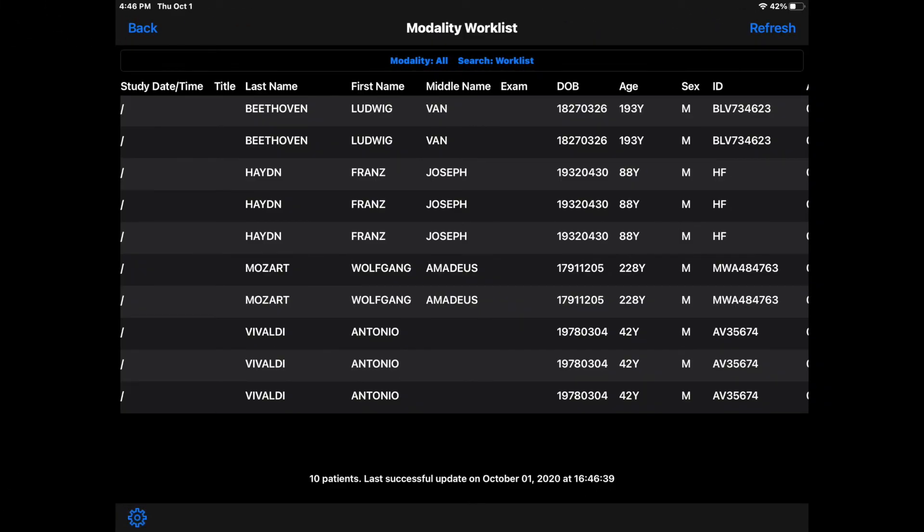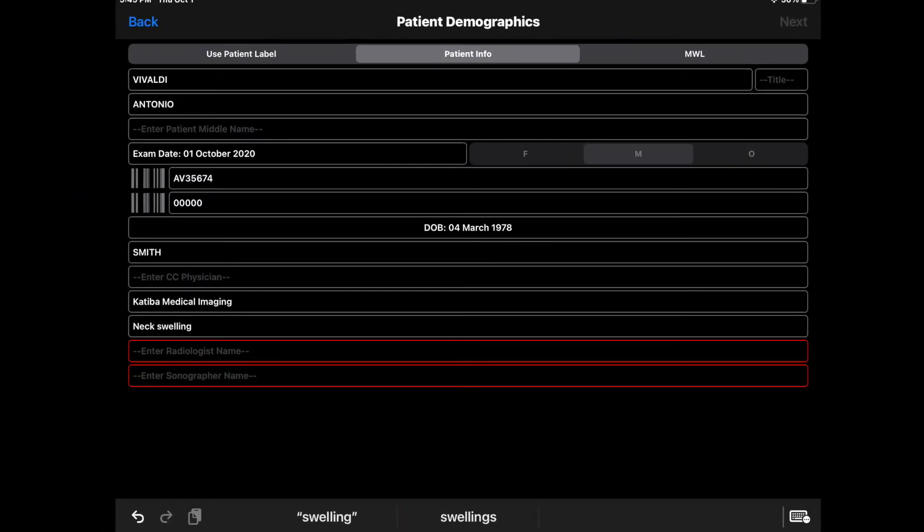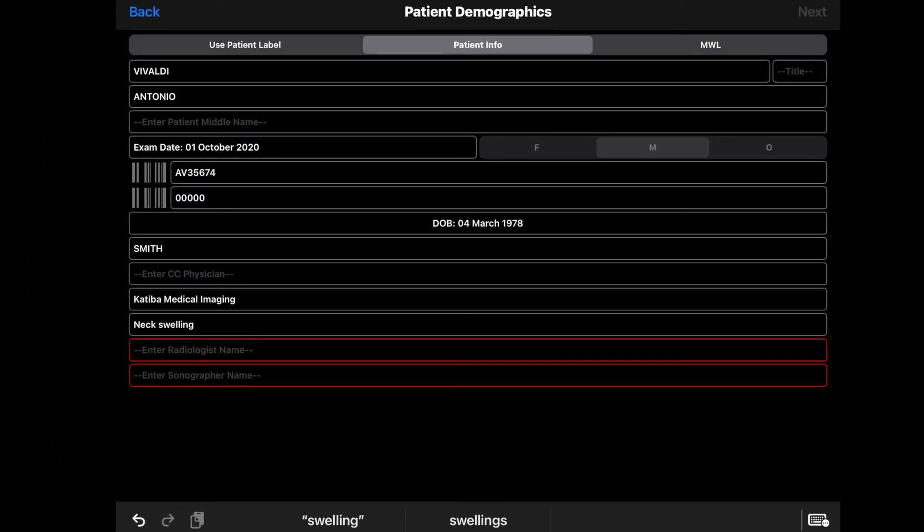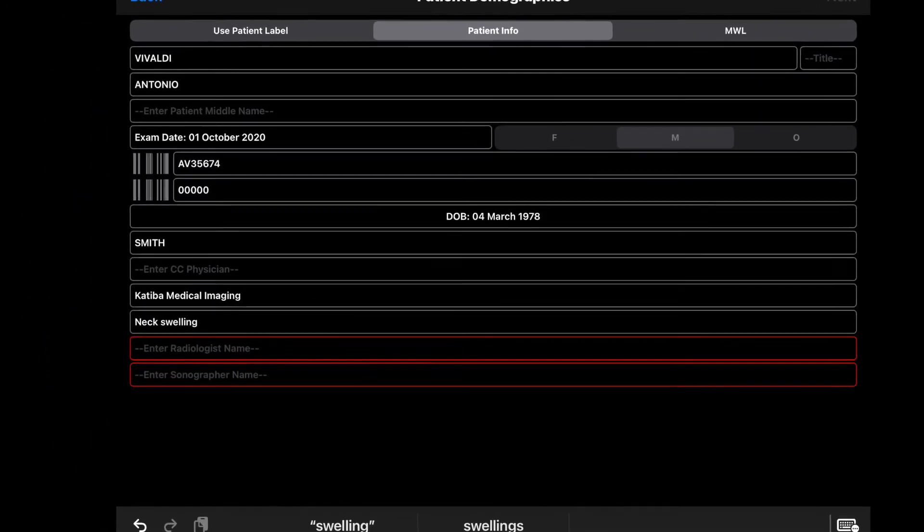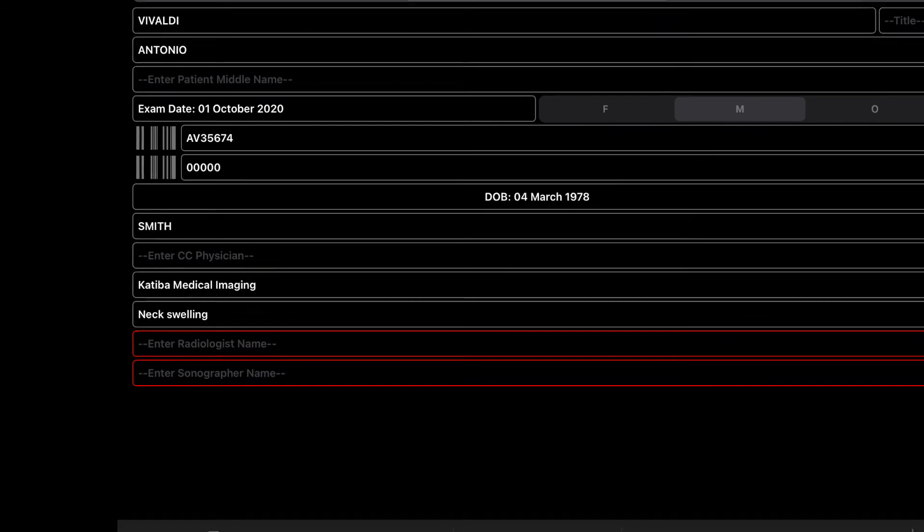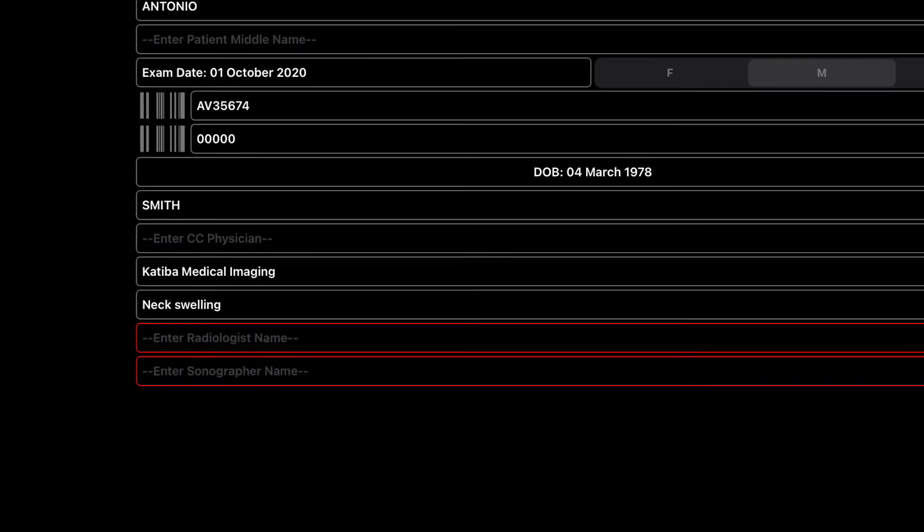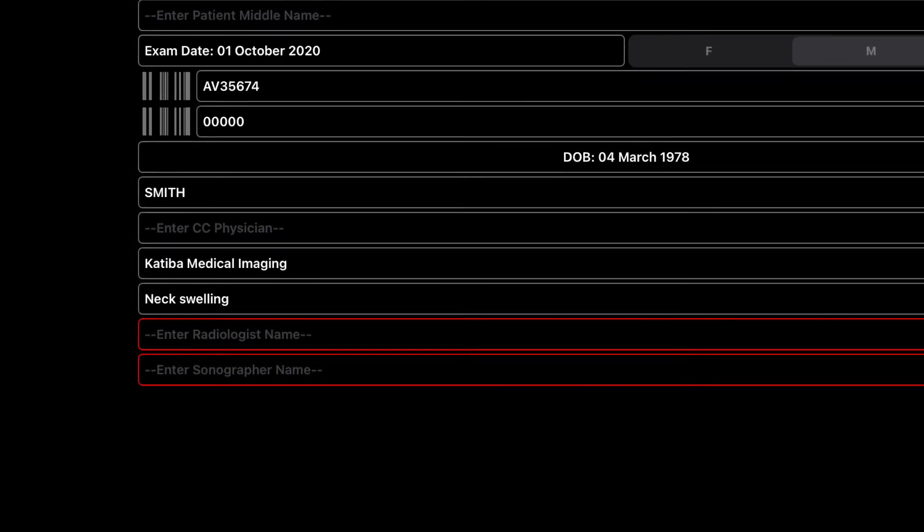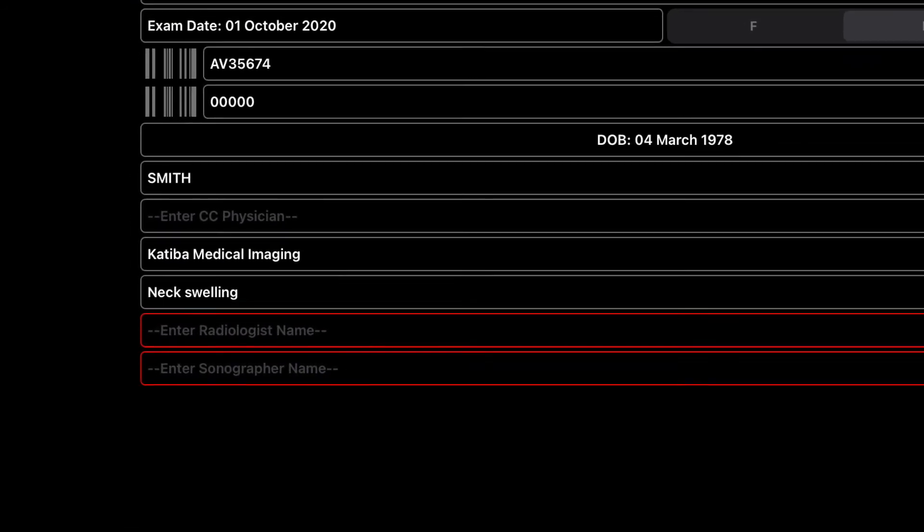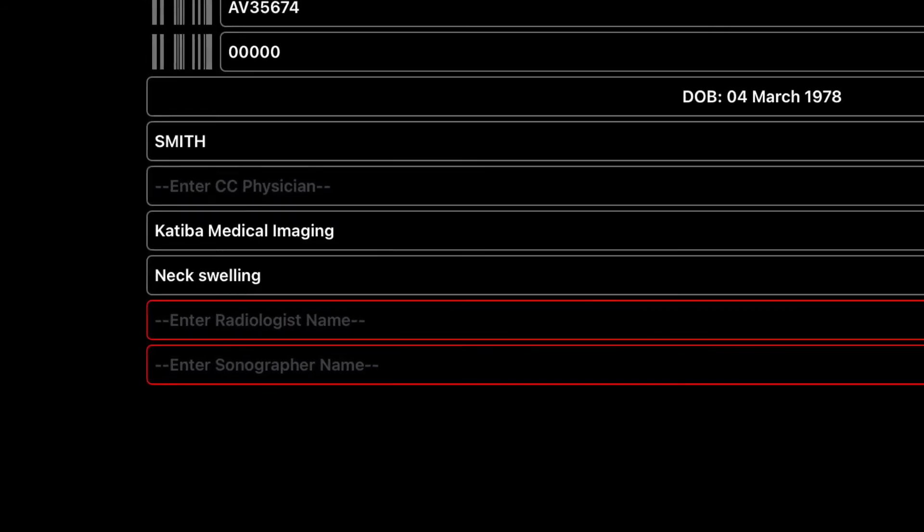To select a patient, tap on a row to automatically populate the demographic fields with that patient. The required fields are highlighted with red borders. You must enter data in the required fields before you can move on to the next page.